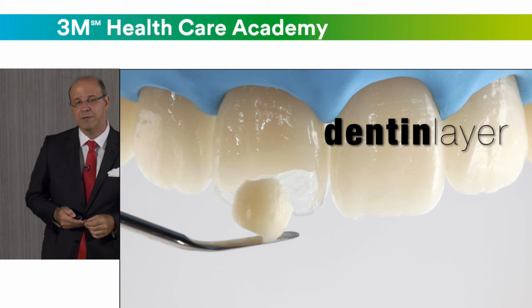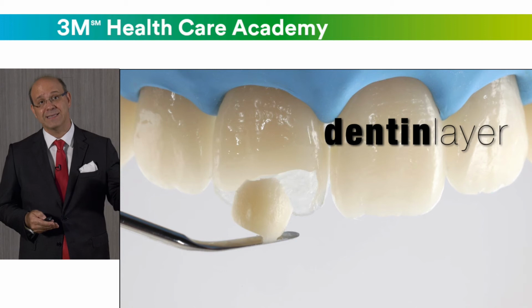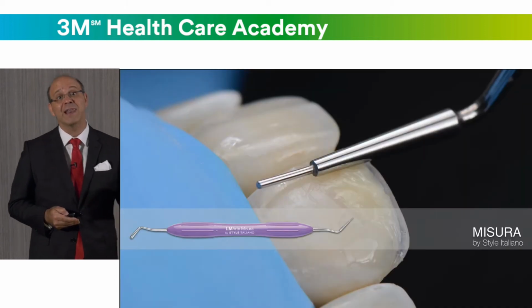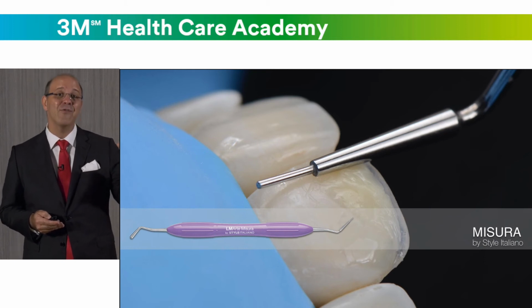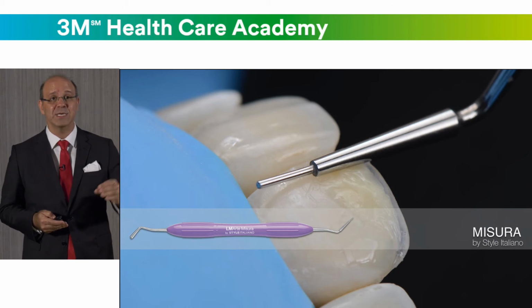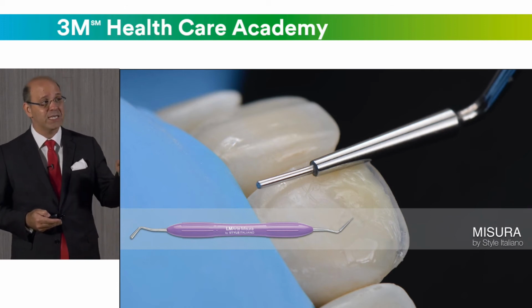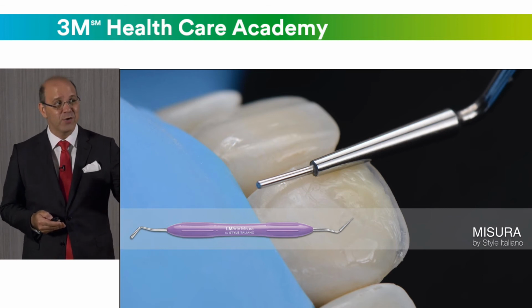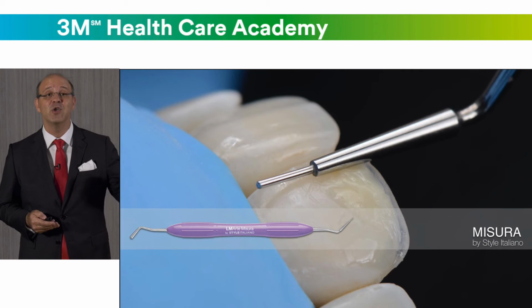Now go for the dentin. When you have the dentin, we have to first compact the dentin, pack the dentin to the palatal enamel, and also we have to calibrate the space for the buccal enamel, the 0.5 millimeters. How can you do that? Usually with this instrument called Misura, developed by our group, Style Italiano. So you just hold the thin part of the Misura on the external part of the bevel, you hold the large part of the Misura on the incisal edge, and very softly, very gently, you pass side by side.